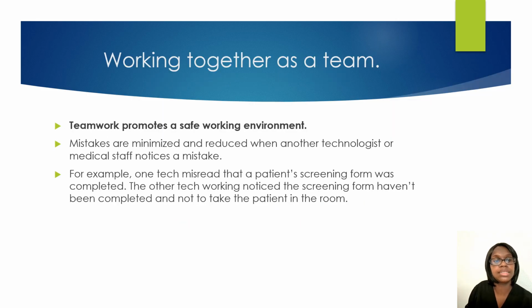Whenever you work together as a team, it promotes a safe working environment, it minimizes mistakes, it minimizes burnout, and the other tech can be on the lookout or can correct another tech. So, for example, if a tech noticed that a patient has hearing aids in, but another tech did not know, you can work together as a team to prevent the patient from getting their hearing aids destroyed or possibly getting a burn while they are inside of the MRI room.